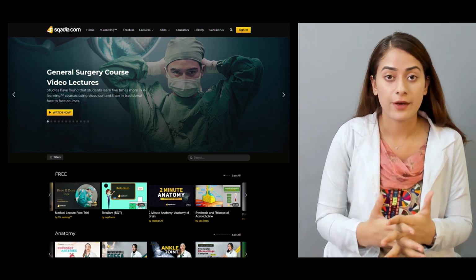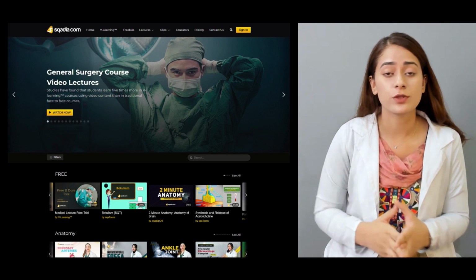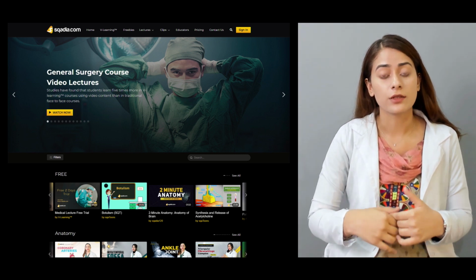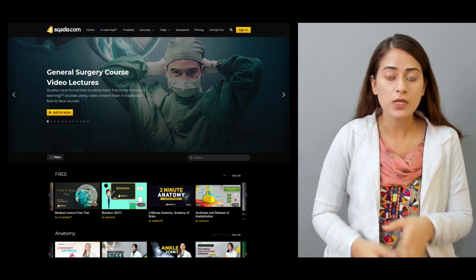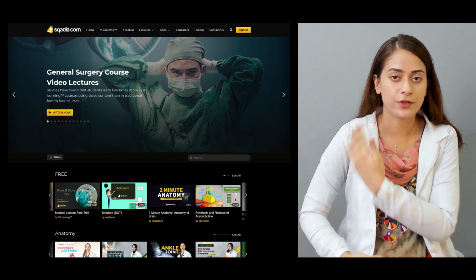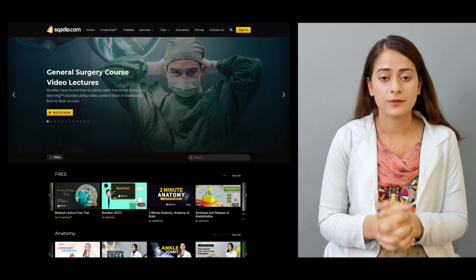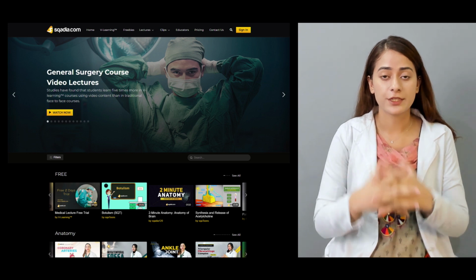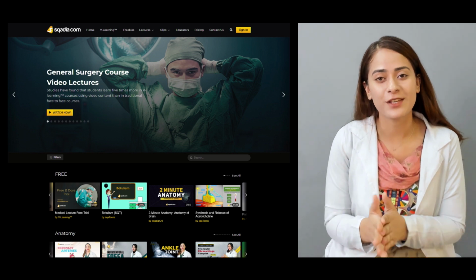We also talked about how a rupture of the bicep tendon appears. We also talked about how it presents if the rotator cuff tendons are ruptured. We talked about all the radiographic interpretations of all these diseases, and I hope I made it interesting for you.